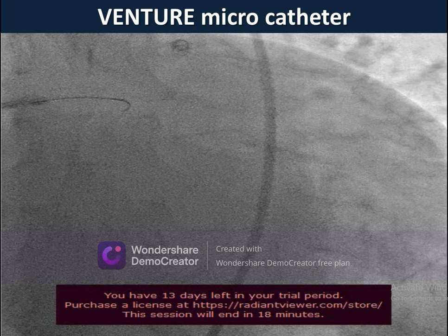It was actually with me, but I learned from this failed trial that I need to abolish this unsuitable physics of this anatomy. So I was obligated to bring a curved steerable tip microcatheter like the Venture microcatheter to abolish these unsuitable conditions of this anatomy.